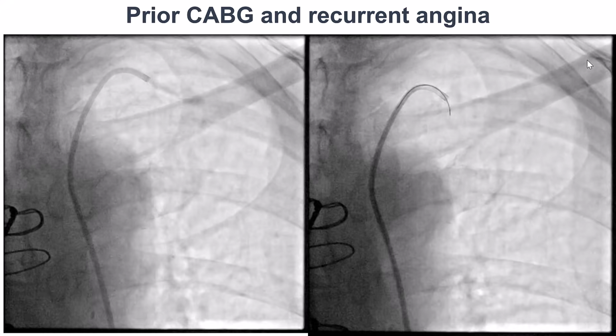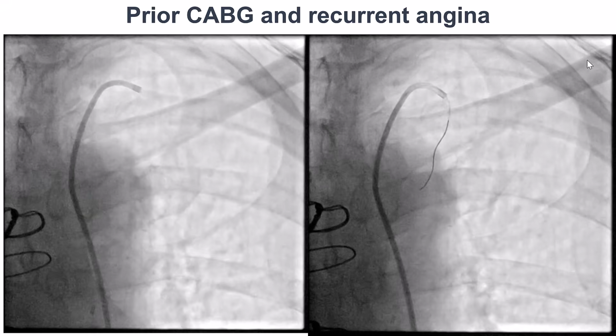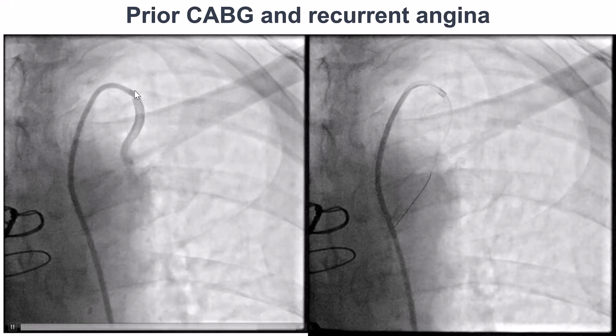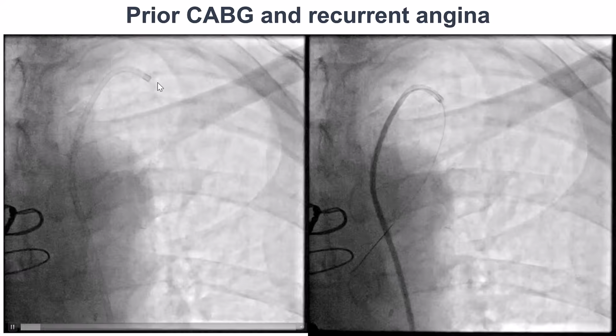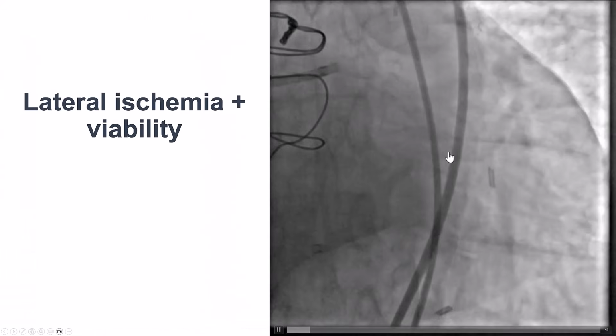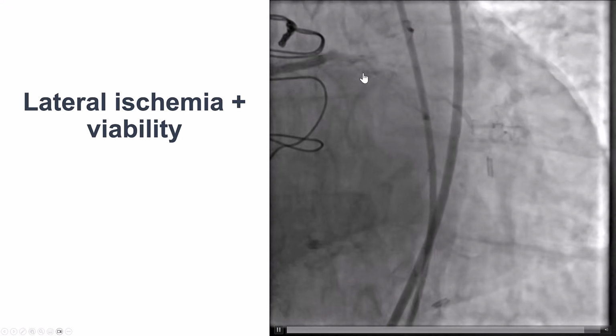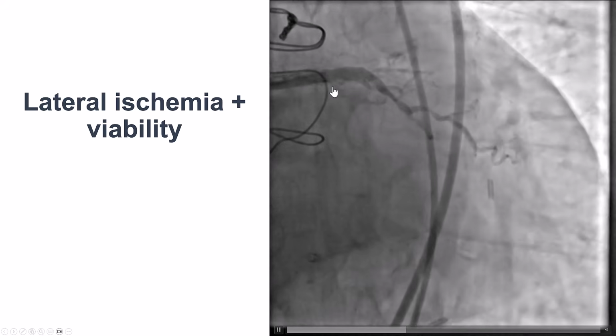The patient had previous coronary bypass. When he came back, the only patent graft was the LIMA to LAD. This is the engagement coming back with counterclock and then advancing a safety wire for the dual injections. And this is the native left main. There's an ostial LAD CTO, but the distal vessel is filling from the LIMA.